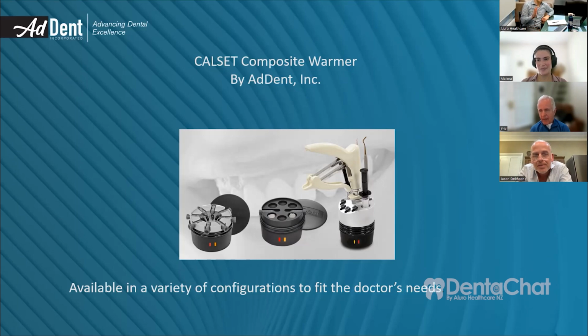So is this a limit that we can hit on composites? Do we need to go higher? Can I try to answer that? Please do, Josh. This happened almost 20 years ago. We were making a Calset heater that was a lower temperature, I think it was 54 degrees C. And we got a call from the University of Oregon, Dr. Jack Ferracane and Dr. Tom Hilton, and they said, "Can you raise the temperature of the Calset?"